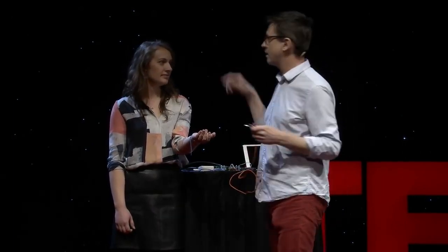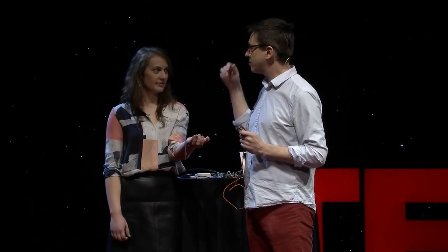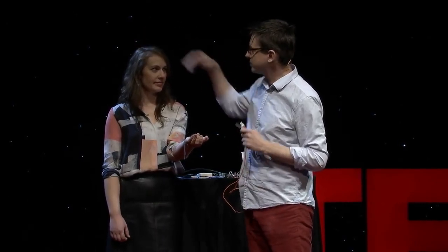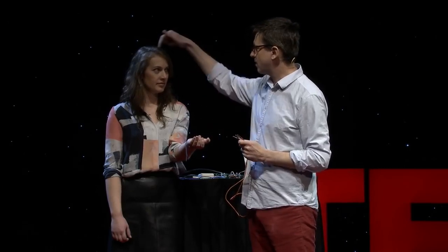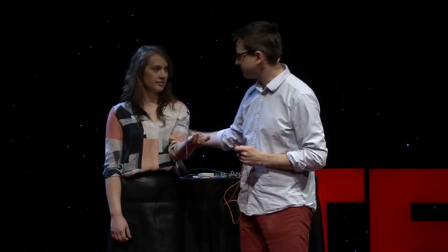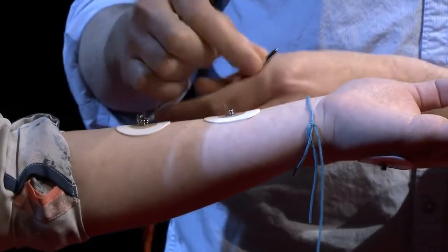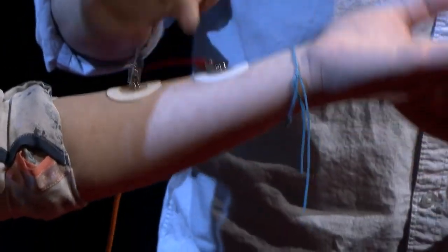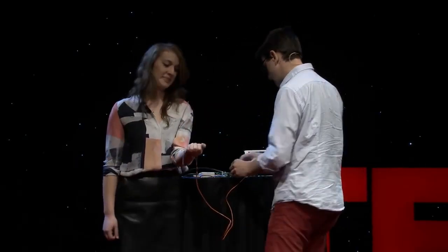You have about 80 billion neurons inside your brain right now. They're sending electrical messages back and forth and chemical messages. But some of your neurons right here in your motor cortex are going to send messages down when you move your arm. It's going to go down, across your corpus callosum, down onto your spinal cord, your lower motor neuron, out to your muscles here, and that is electrical discharge. It's going to be picked up by these electrodes right here, and we're going to be able to listen to exactly what your brain is going to be doing.